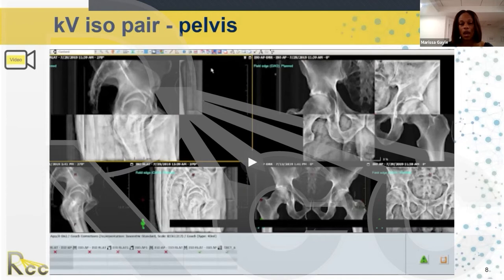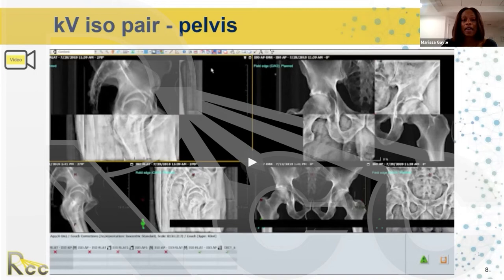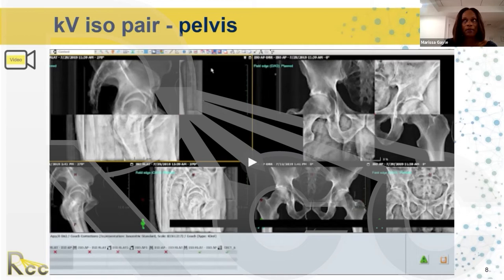It's very important to note the CT SIM. To ensure your matching each day is as accurate as possible, you need a good SIM — a good starting point. Make sure patients have great immobilization devices: for GYN patients, a vac lock with arms above their head especially if treating the paraaortic region. For prostate patients, make sure they don't have bulky clothes, just a gown and sheet on an immobilization device. This greatly increases the ability to reproduce the setup with as little shifts as possible on a daily basis.